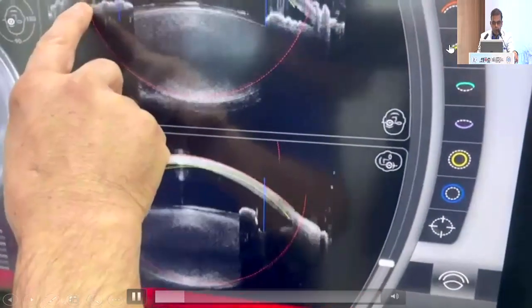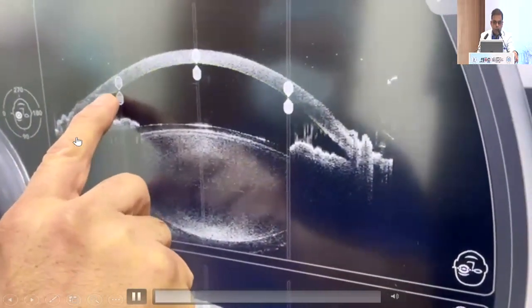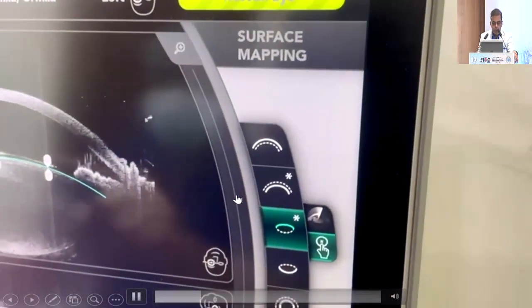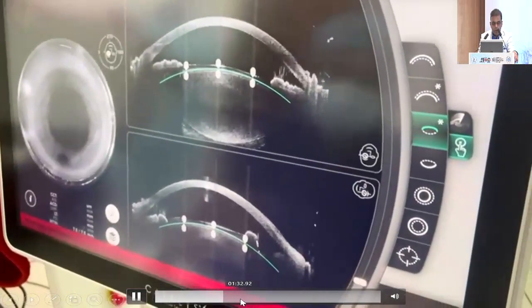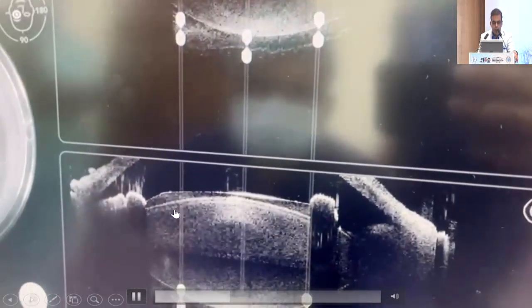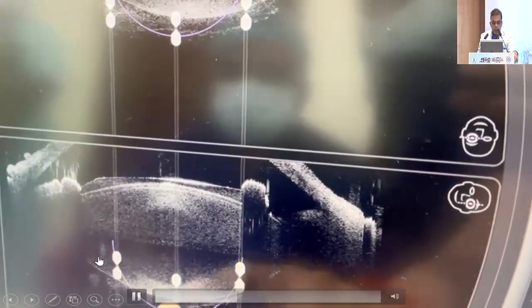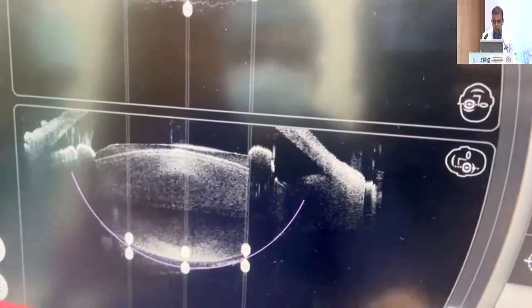In the surface mapping, we go to the anterior and the posterior. This is the posterior part — we adjust it. This is how we adjust the integral guidance system. Now the posterior part is done. For the anterior surface of the lens, we do a little bit of adjustment, and then for the posterior surface of the lens as well. We are adjusting it so that it should not cut through. This is a very steep surface, but we are adjusting it manually. This is a very good option with the Catalyst machine — you can adjust and manipulate it, and the integral OCT will ultimately work with that.